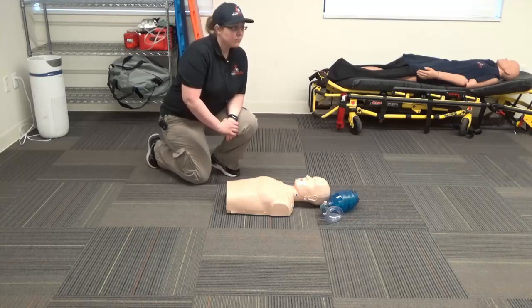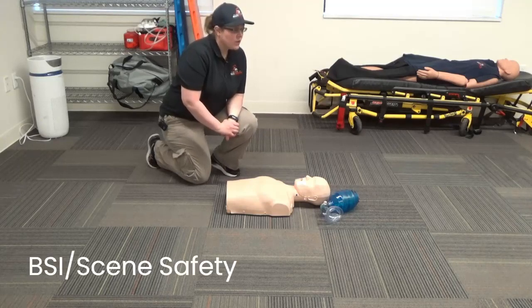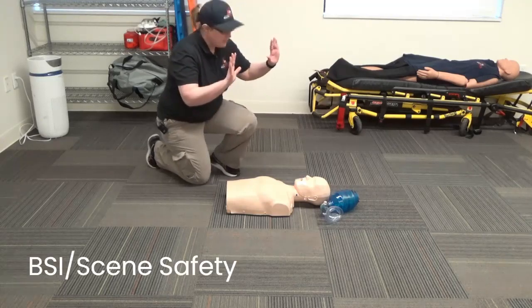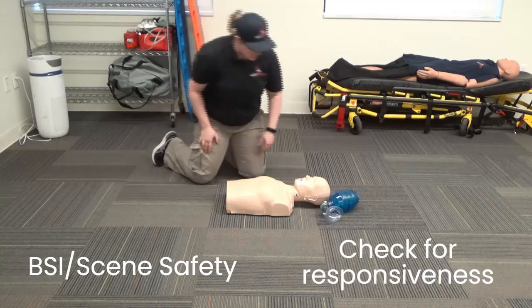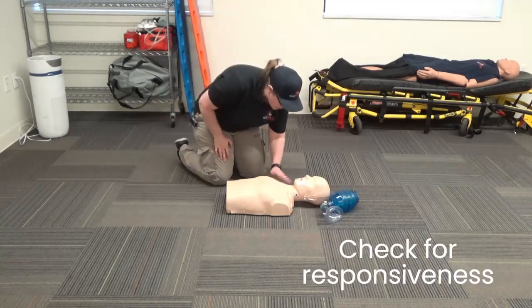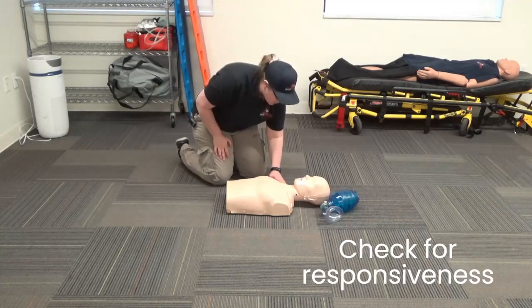Your scene is considered safe. BSI, scene safety. Check responsiveness. Hey, are you okay? You see no signs of life.